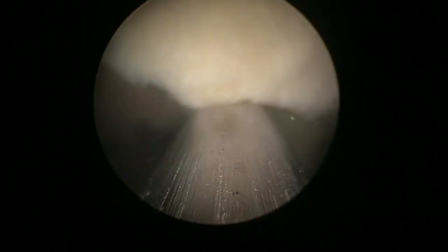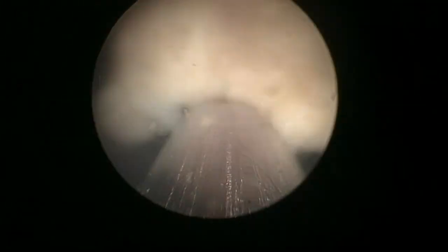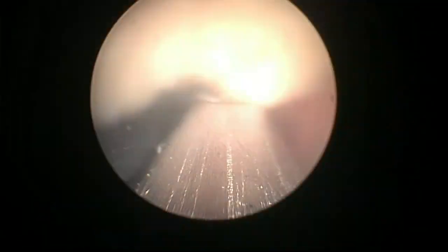Morcellation is an active situation where your brain has to be working. You have to pay attention to detail to make sure that no accident happens. We do 80, 90 cases per month, and we rarely see an accident of morcellation. Typically, if you follow the safety rules of morcellation, it's quite unusual that you will cause any damage. But of course, you need the help of the people in the operating room to keep an eye on the water while you're looking at the screen. So it's a complete, efficient teamwork that makes this procedure a success.